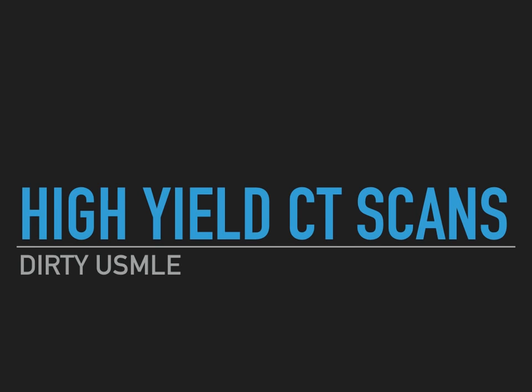what I want you to know is that most people experience at least 5 CTs on their Step. So we're talking at least 5 questions, give or take a few, but it behooves you to understand a CT scan and be able to read one because honestly, it's a very simple task. You're looking at oftentimes normal structures that you've seen in anatomy, and you just have to figure out what's going on and what the arrow is pointing at or what the letter is on.